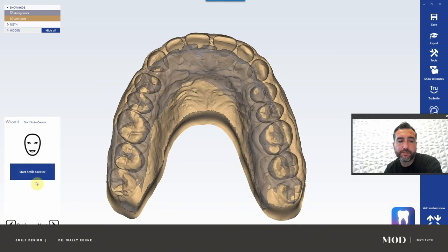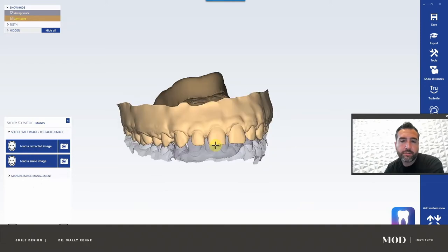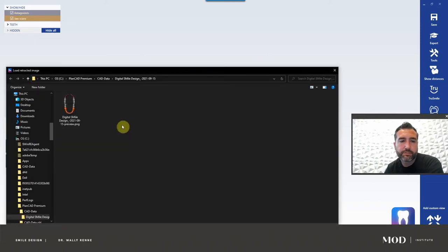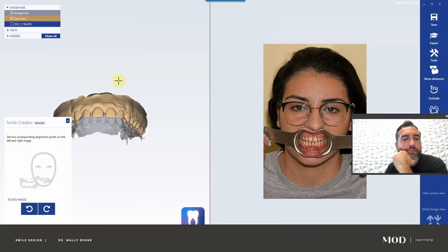Now it prompts you for Smile Creator. If you don't have this, that means you probably don't have that feature of the software and you should contact Mecca. So start Smile Creator. The first thing it does is ask for a retracted image. Let's find that — it's under my downloads. If you downloaded the case, I think it's this one. Yes.